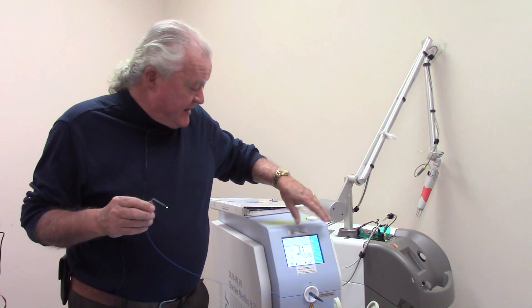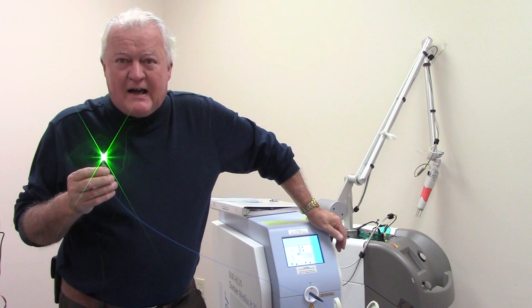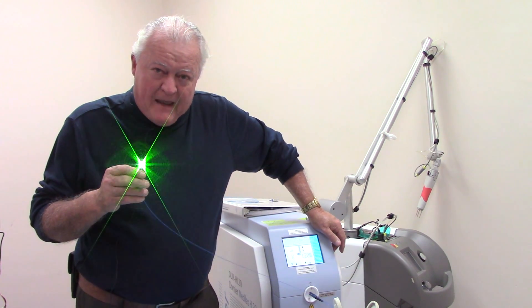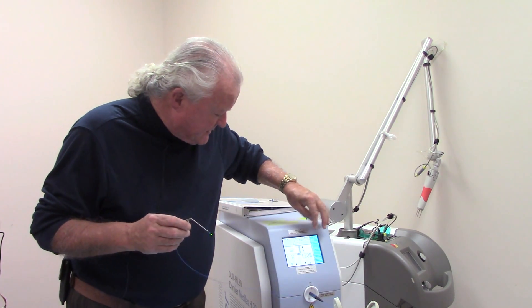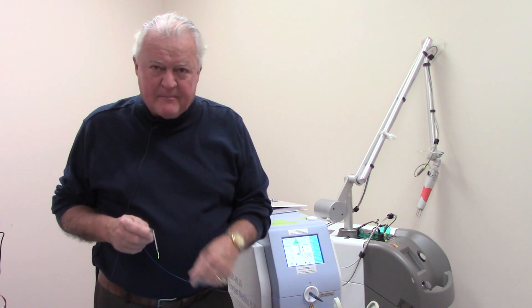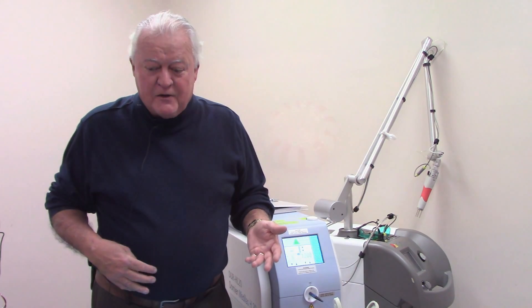We're using a Holmium YAG laser to demonstrate this, but the principle applies to any type of fiber laser. The first thing I'm going to do is mess up the tip of the fiber by firing it into something. Here the Holmium YAG laser is set on 1.2 joules and six times a second. I'll do a close-up so you can see it firing into a piece of candy — the only reason is just to mess up the tip so we can create a new one.